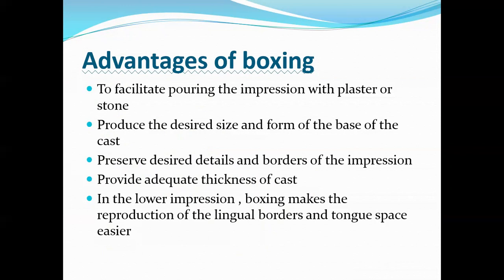Boxing of the impression is the enclosure of the impression to produce the desired size and form of the base of the cast and to preserve desired details.